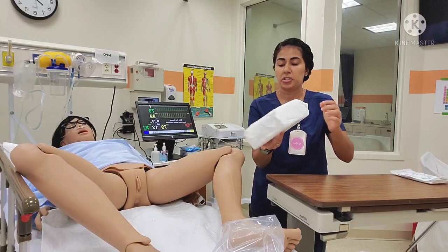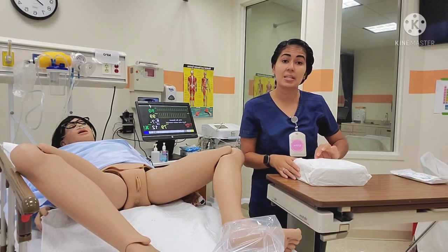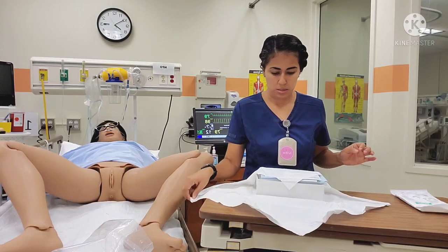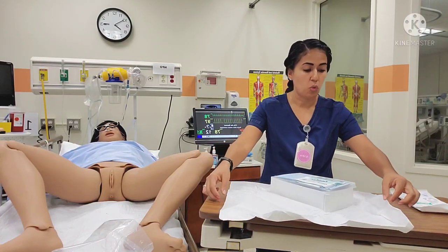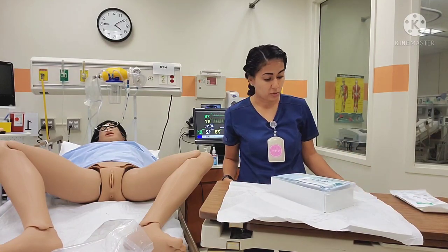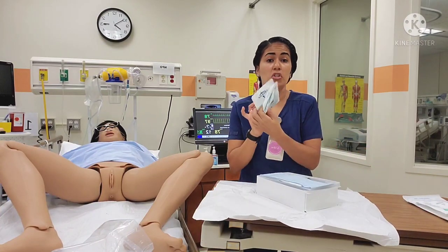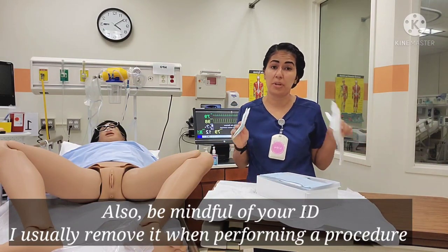The kit has a flap — the one that goes away from you is the one you open first. I do not want to reach over; I'm going to open to the side, then the right side, then the left side, and the one closest to me is last. We can touch the one-inch border, which is considered non-sterile. Anything hanging over the overbed table is also considered non-sterile. The first thing I see are my sterile gloves and I'm going to put them on over to the side of the table without putting my back to the sterile field.